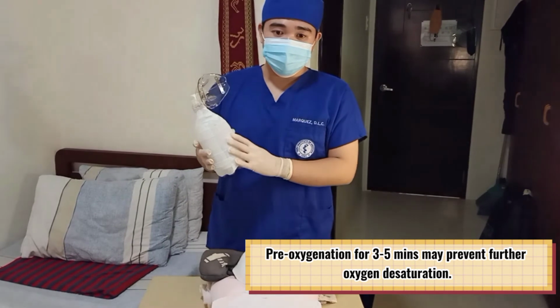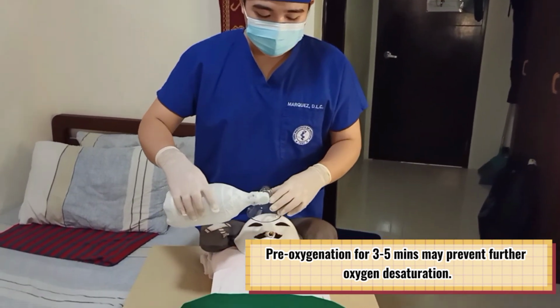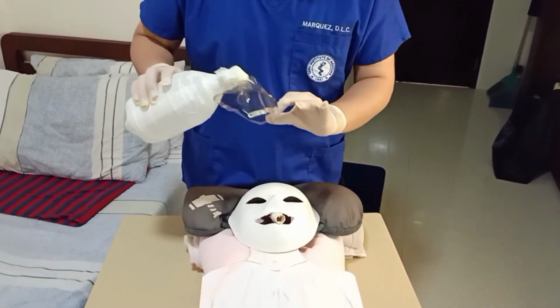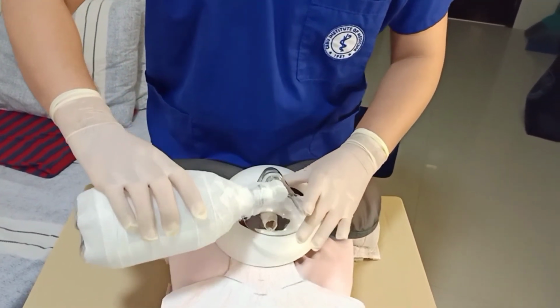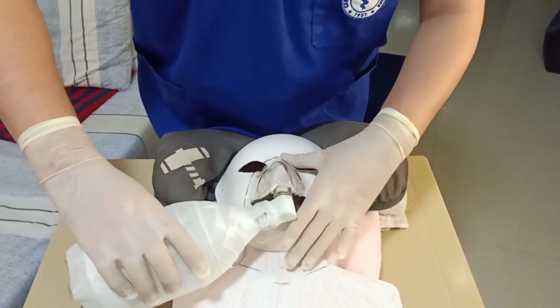Pre-oxygenation using the bag valve mask for 3 to 5 minutes effectively leads to nitrogen washout and prevents oxygen desaturation during the procedure. Make sure that the mask is well fitted and there is no air leak. The superior angle of the mask is fitted into the lowest point of the bridge of the nose. The left hand then lifts the mandible anteriorly until the chin meets the cushion.